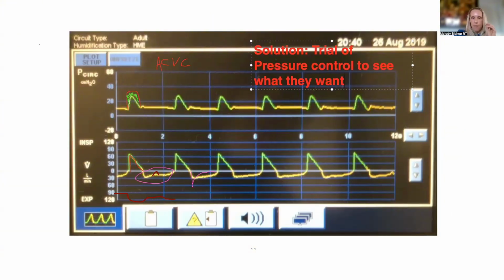Yeah, I think what I would hope to see within a few breaths of the switch to pressure control is, once you have fixed this flow starvation, that as the patient's work of breathing decreases and they feel more comfort, they start to slow down. With that, you're going to correct the auto peep. Right. Exactly. And with that correction of auto peep, they're not going to feel as much work in order to initiate a breath, which then will also hopefully help them settle their breathing even further.